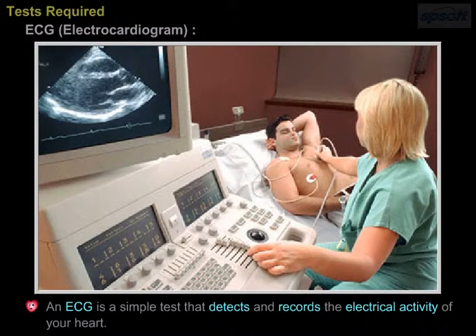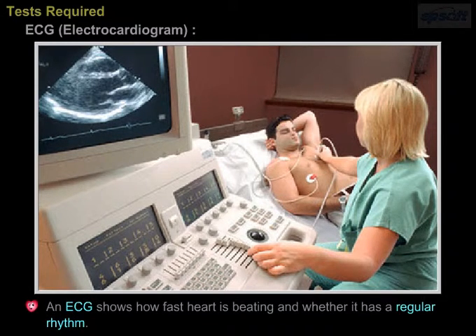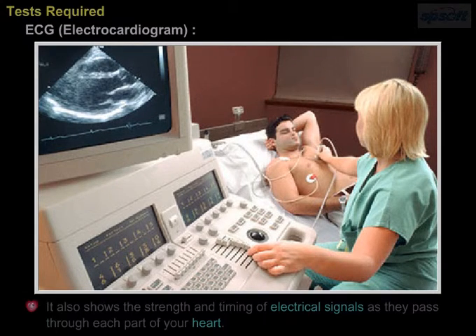Tests required. ECG, electrocardiogram. An ECG is a simple test that detects and records the electrical activity of your heart. An ECG shows how fast the heart is beating and whether it has a regular rhythm. It also shows the strength and timing of electrical signals as they pass through each part of your heart.